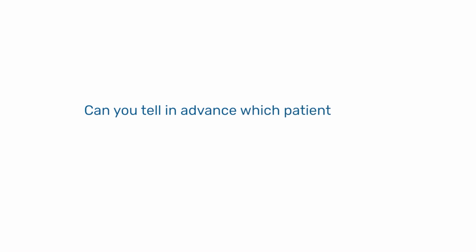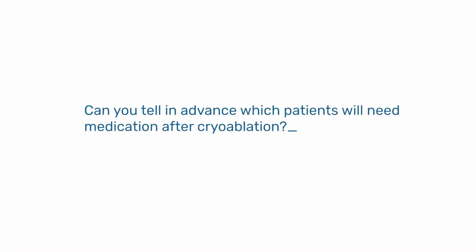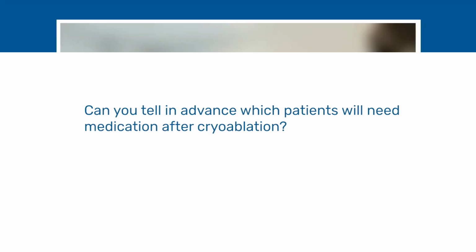So it sounds like it's unlike resection, where Dr. Spencer said she could probably tell in advance who she's going to do a resection on, and then they might need medication later. This is different. Most times, yes, because it depends on which kind of patients you are accepting to do cryoablations on. If your patient selection is good, you can tell that the cryoablation is going to work here, and most times it will. If it is not the kind of patient who is ideal for cryoablation, then they shouldn't go for cryoablation. They should go straight away for resection or try medical treatment.